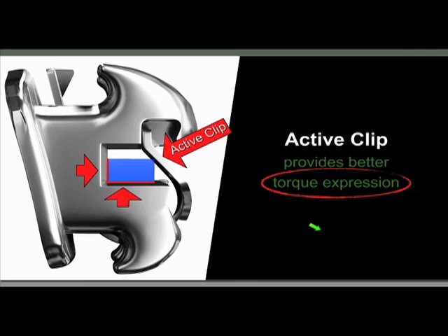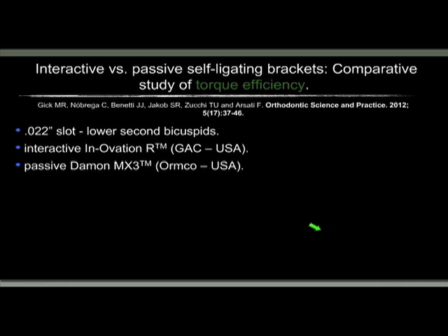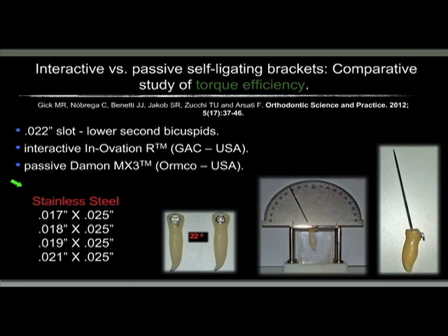And it's been shown that active appliances provide very good torque in wires that are less in size than the 022 slot. I would like to show you this study done by Dr. Nobriga and colleagues, evaluating the torque efficiency of two different appliances, an active and a passive self-ligated bracket, all 022 slot, and I will show you specifically the lower second bicuspid.